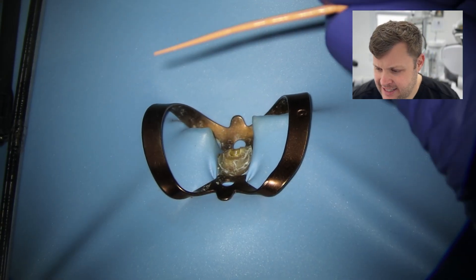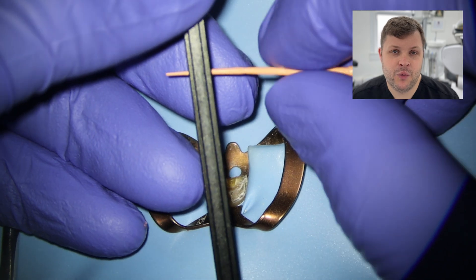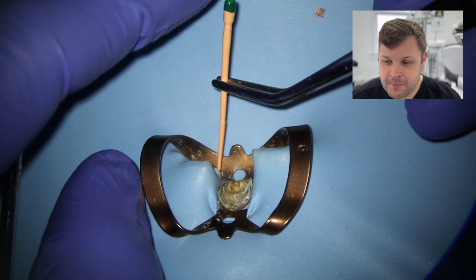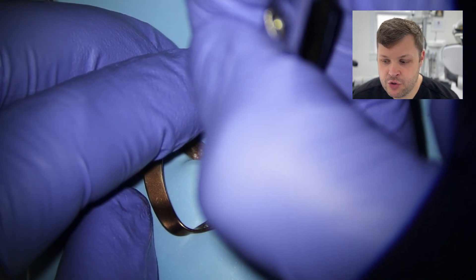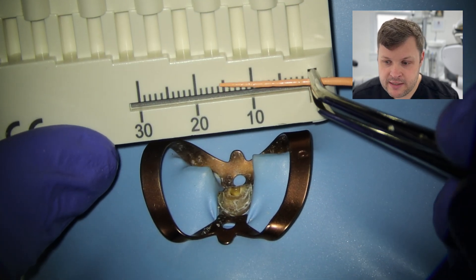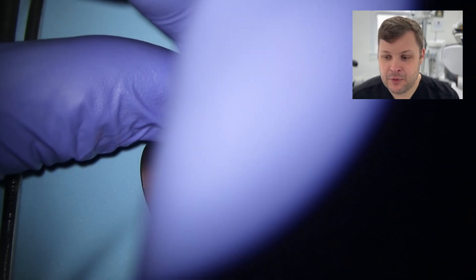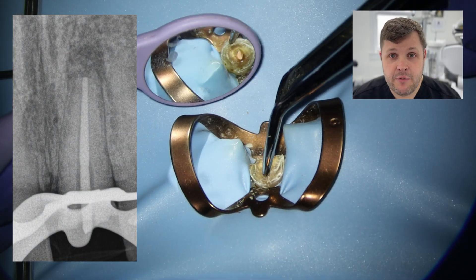I'm going to get a large-diameter GP point and guesstimate the apical diameter. I'll be conservative — I've got a GP cutter here that cuts the GP to a certain diameter. I've estimated the apical diameter is size 60, cut it, fitted it to length, and I can feel that snug tug-back. Picking it up with tweezers and measuring the length, it's 15.5mm — I just guessed correctly. We're going to snip it off and take a comfort radiograph. It looks fantastic — to length, looks nice.